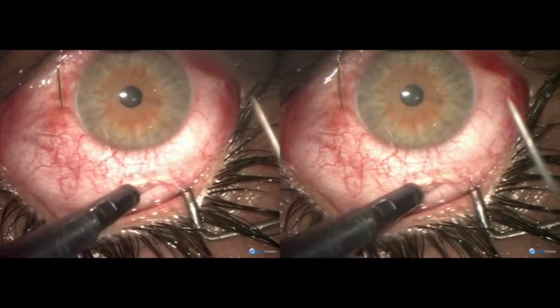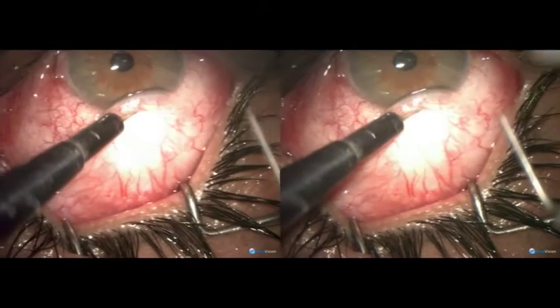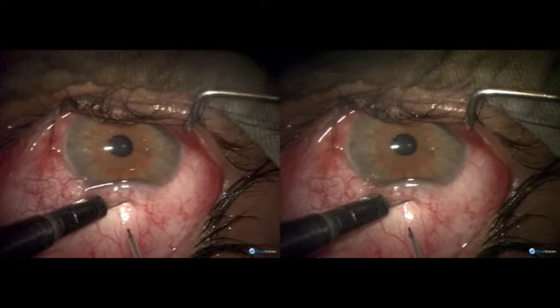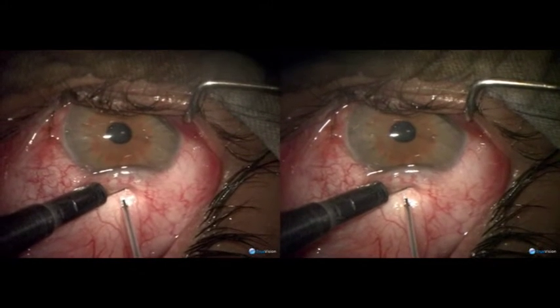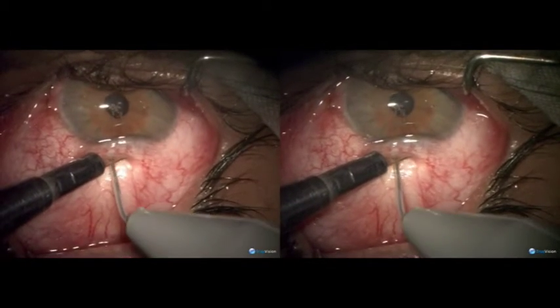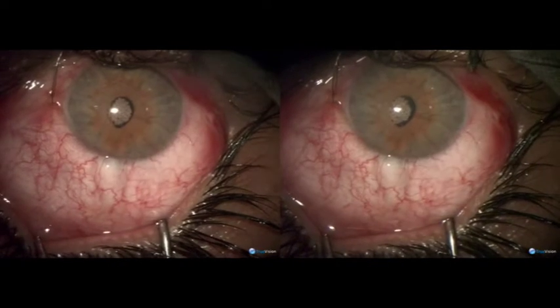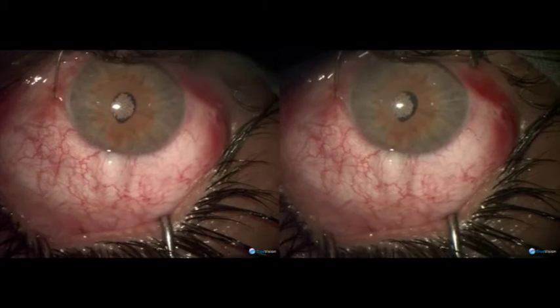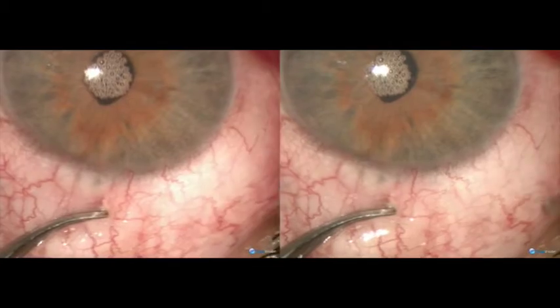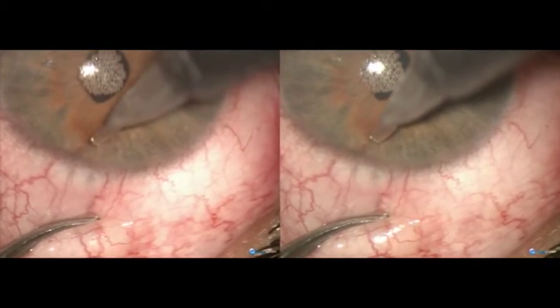This young patient with posterior uveitis, who is getting intravitreal injections for control of inflammation, has uncontrolled glaucoma. We are therefore forced to do filtration surgery. Two treks with a 200 micron fugoblade have already been made.